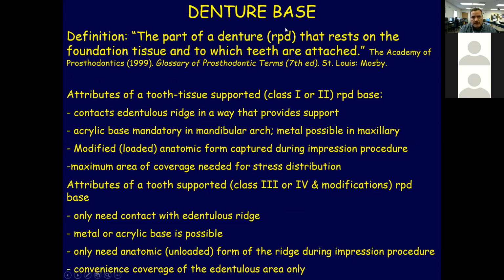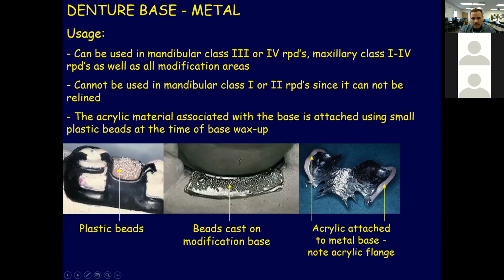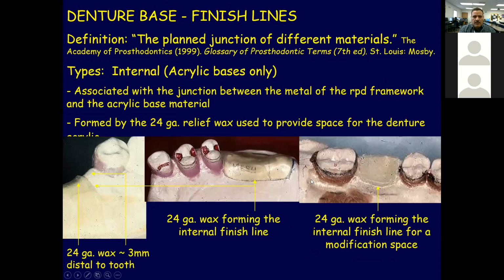The denture base is usually made of acrylic, where you put the fake teeth. Usually it's a mesh or like this way, so the acrylic will go in and out, and we put the teeth over it. And sometimes we make it rough, so the acrylic will hold, and then we put the fake teeth.